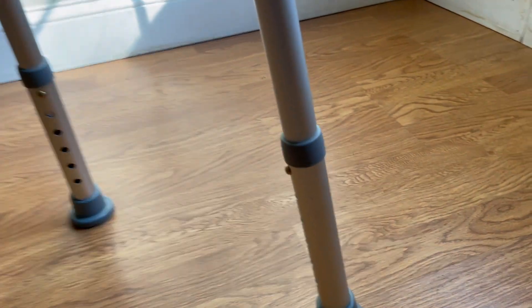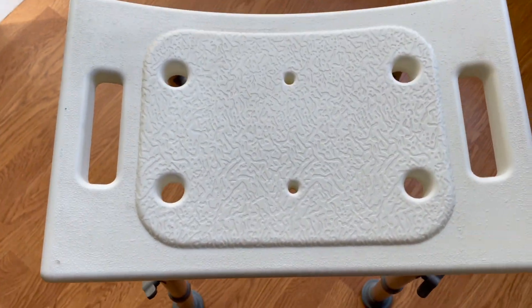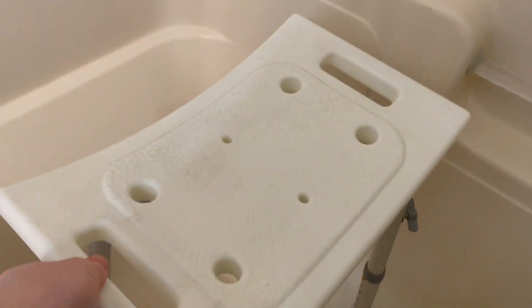A couple of my favorite features: it's light, only about four pounds, but it's rugged — it can handle up to 350 pounds. It's also adjustable, so if you need to change it for height or for whatever reason, it's very easy to do.